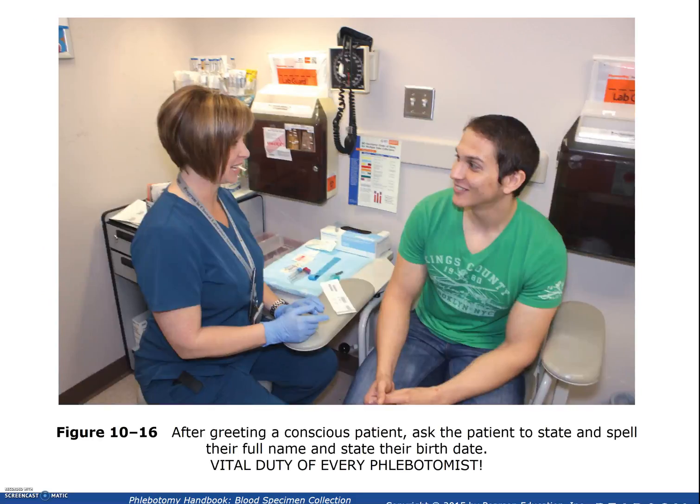So after greeting a conscious patient, we're going to ask the patient to state and spell their full name and their date of birth. This is vital for every phlebotomist. We're going to compare this against our requisition and either an armband on our patient or a driver's license in an outpatient setting.